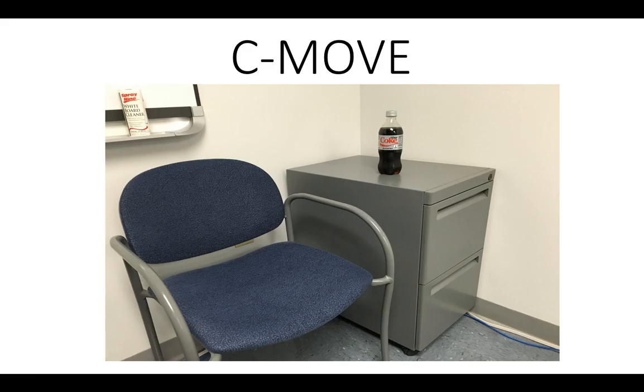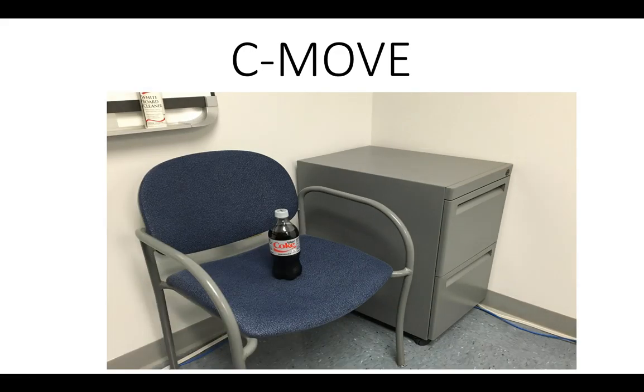Here you see the DICOM object on the file cabinet, but I want it on the chair. How am I going to get it there? I will try to move it with my mind. That did not work. I need some kind of a service to move my DICOM object from the cabinet to the chair. Yes, C-move is the answer.